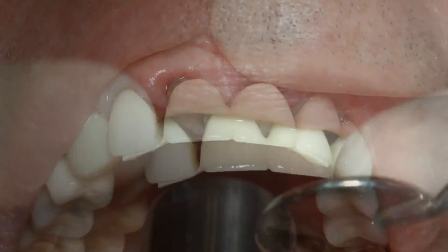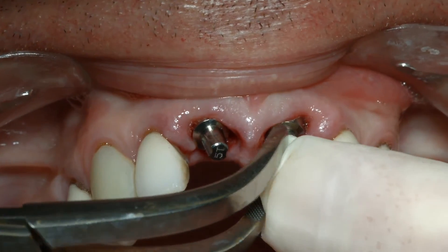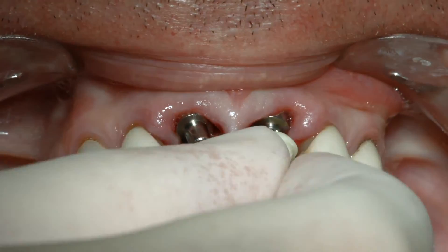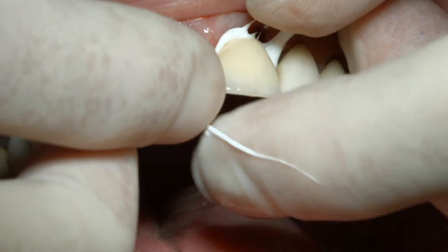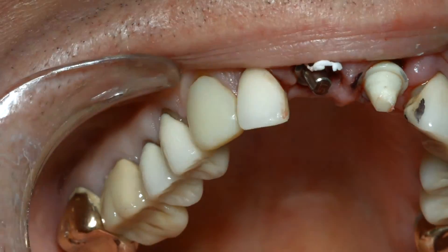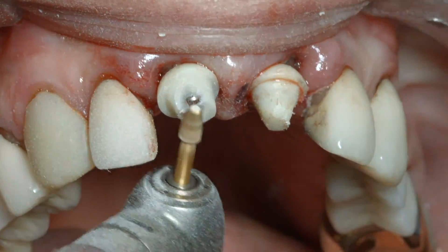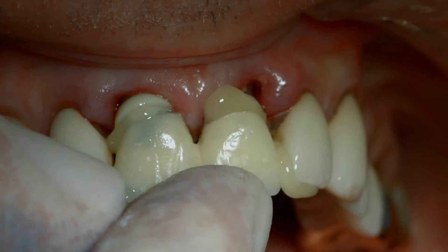Unfortunately, the prosthesis did not fit well and necessitated changing the right straight abutment to an angled abutment prior to adapting it to the modified temporization sleeves. A white fit checker and a black ink marker were used to facilitate the modification of both the TRINIA prosthesis and the modified temporization sleeves prior to its being cemented with a resin cement.